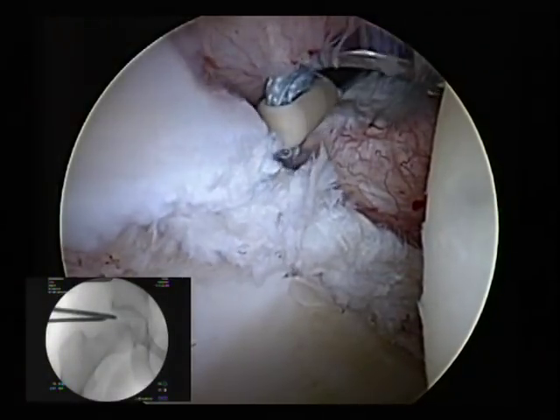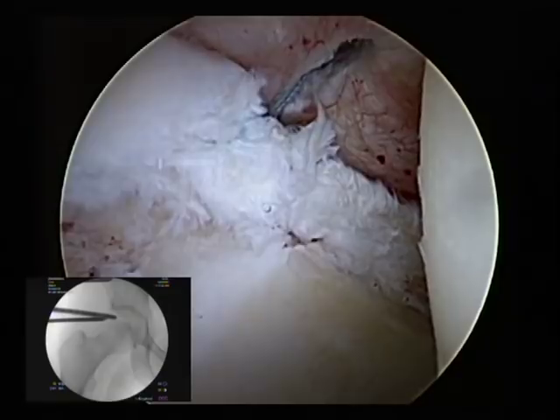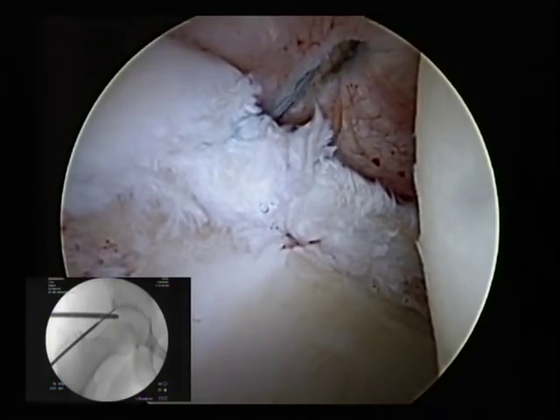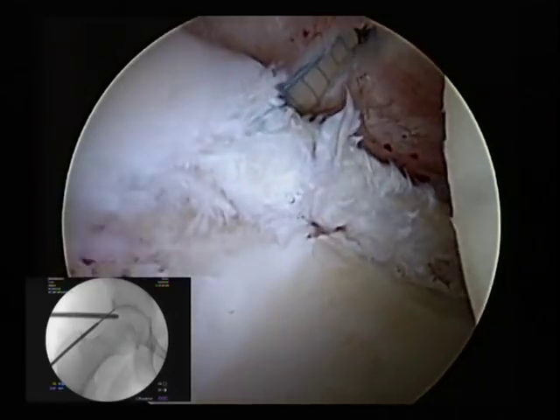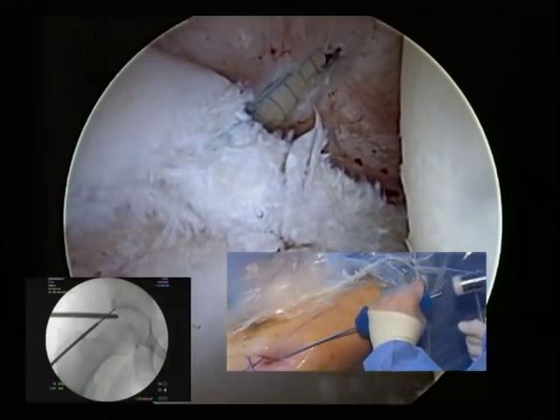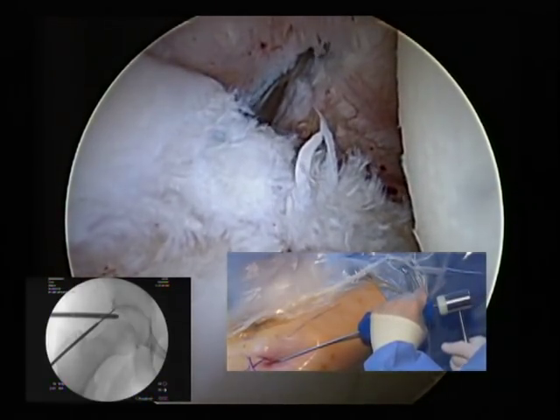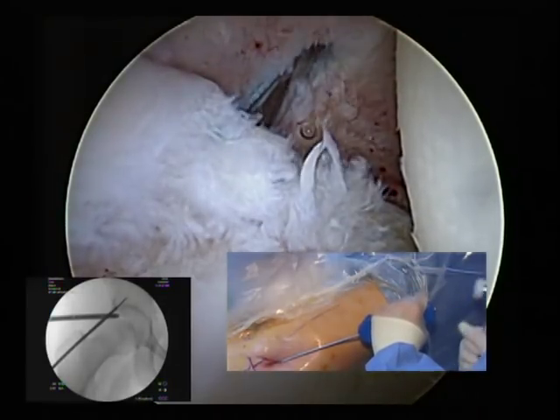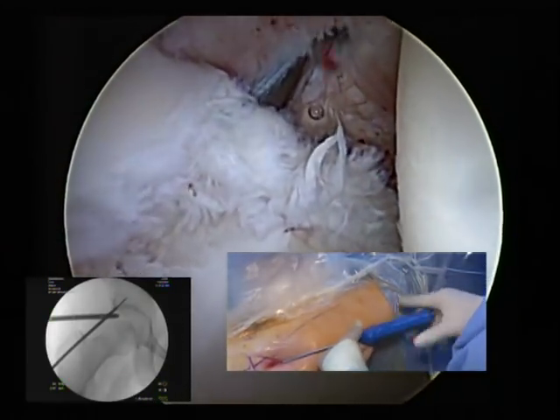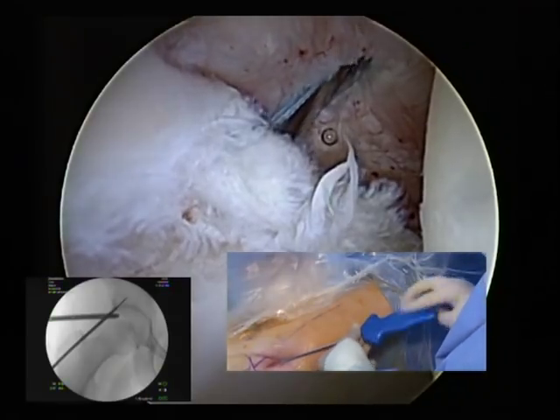Now I have to walk my way over and find my drill entry point, then confirm radiographically that I'm in roughly the same parallel. I advance my cannula as far as it will go, and that essentially locks down my stitch — it's done advancing with regards to the tightening of the labrum. Then I'm going to impact the shaft portion of the push lock. Confirming the same orientation. Once we're done seating the anchor, we simply turn counterclockwise about six or seven times. After the six or seven turns, we start pulling back along the shaft of the device, and now our device is engaged.